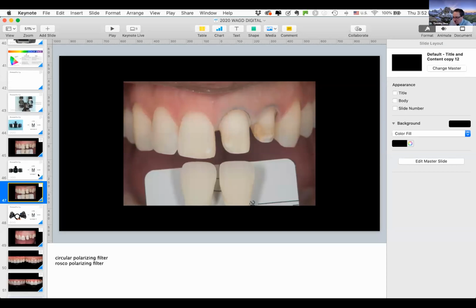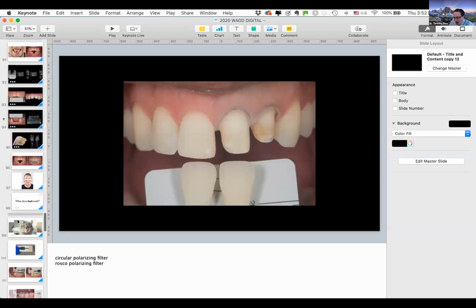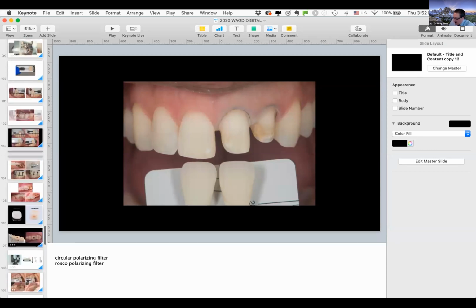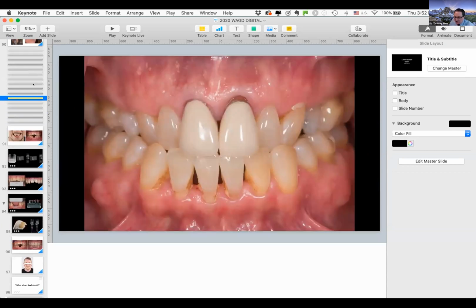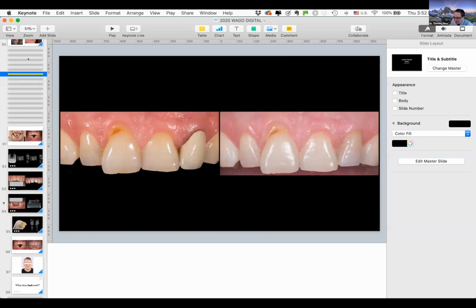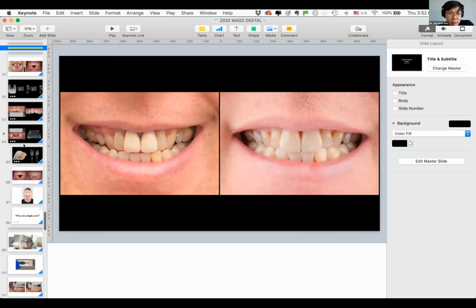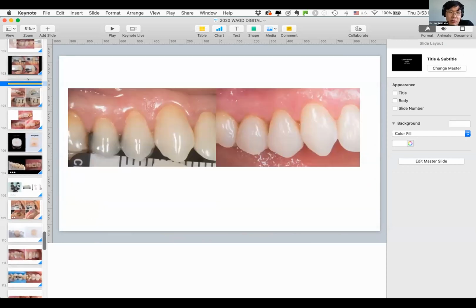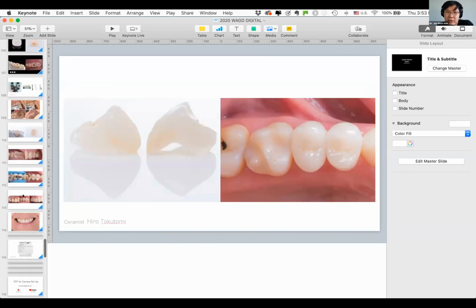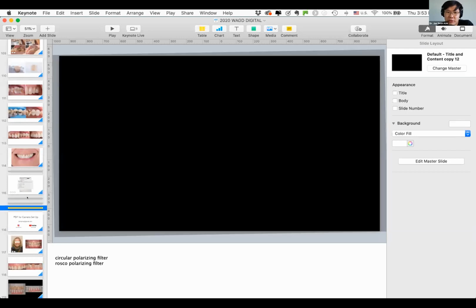Monitor calibration with the lab. They want you to talk more about it, and then we will roll this other question in. What if you're shooting in Adobe RGB and your monitor doesn't have that full gamut? Is there any advantage? Probably. You can switch to shooting in sRGB, but because you have more information, I don't think it hurts to have more information.